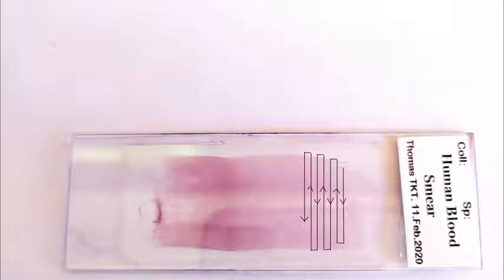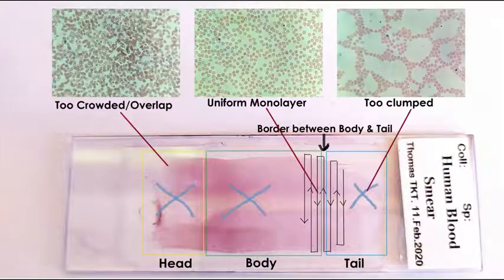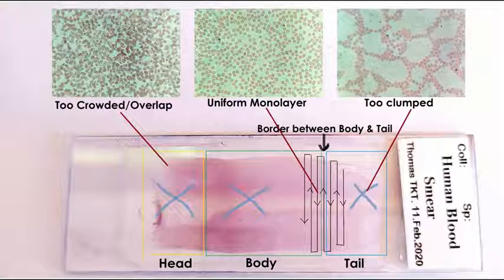Another good practice to obtain accurate counts is to avoid as much as possible the extreme corners of the blood smear, that is, the corner where the smear began and the corner where the smear ends or tapers. In fact, the most preferred site to perform a DLC count is the region in and around the borderline between the tail and the body of the blood smear. This is the region where the cells are uniformly spread into a monolayer without any clumping or overlapping. Count at least 100 or 200 white blood cells to get reliable results.